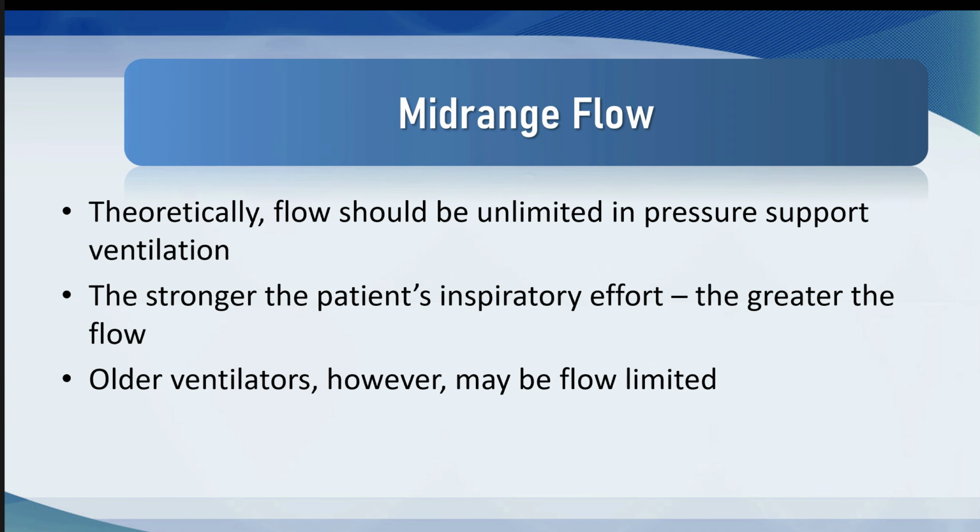Theoretically, flow should be unlimited in pressure support ventilation. The stronger the patient's inspiratory effort, the greater the flow. However, older ventilators may be flow limited.